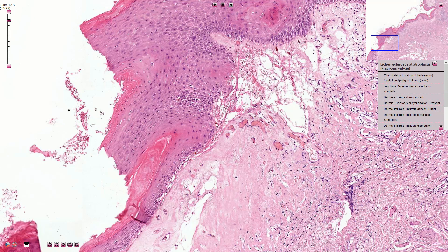Some cases of chronic lichen sclerosis can be complicated by dysplasia, and rarely we can see development of squamous cell carcinoma.